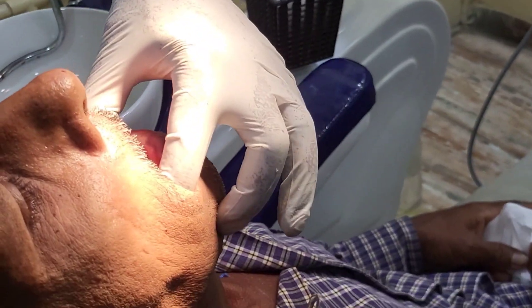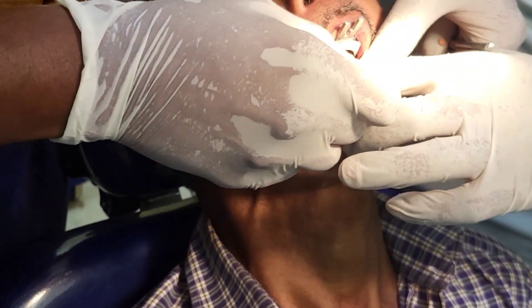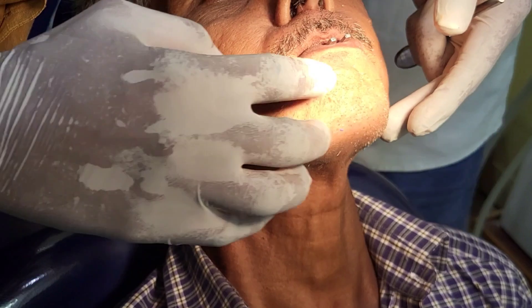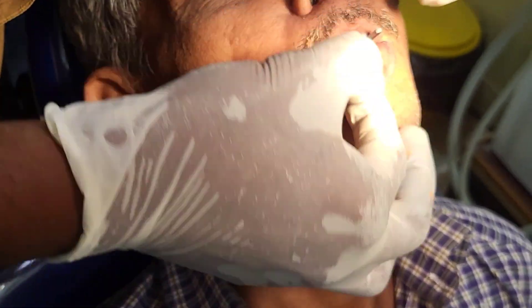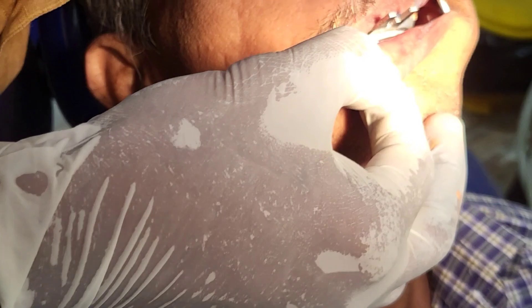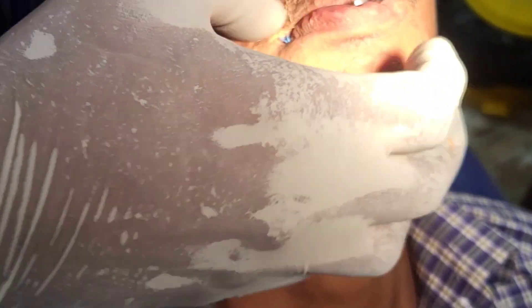Next, we are taking the secondary impression of the maxilla. We place the impression and ask the patient to bite since it is the BPS procedure. The patient is asked to chew the handle of the special tray and then smile widely.